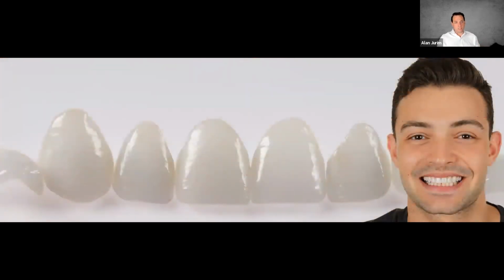And it helps guide the process to end up with a better result, because now we're systematically recording the right information. We're transferring to the patient more accurately, and we're also able to share that with the laboratory as well. For example, when the patient likes their provisionals and those are digitally scanned, we will print a model of that, and then we will send it to the laboratory digitally. The laboratory can print it, and they can then use that as a reference as they're finishing the case. They're building a porcelain, so they can actually physically see what the patient has approved and what they're creating for us. Again, another good technique to improve the quality and predictability we're bringing back to the patients.